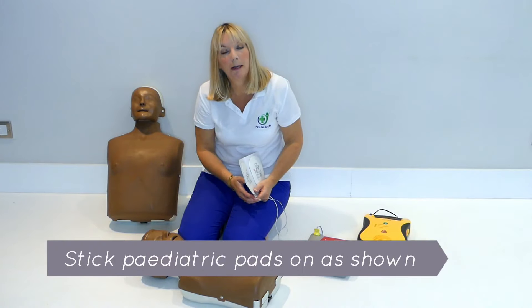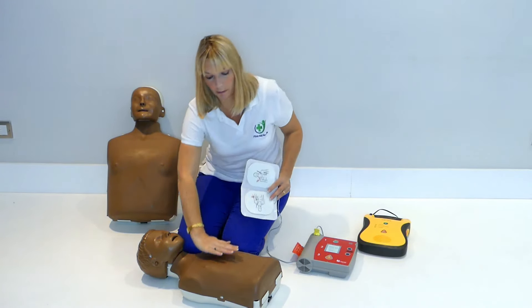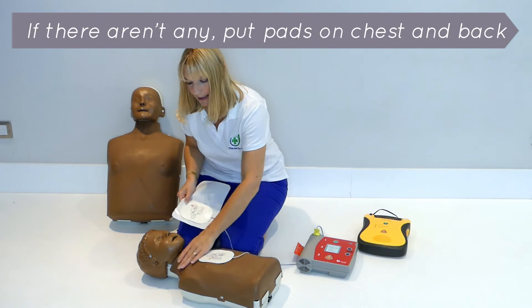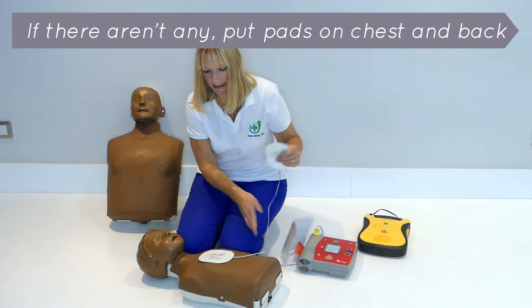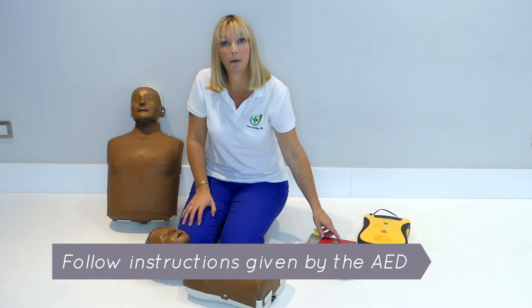If you don't have pediatric pads, you can use adult pads. You put one on the front of the chest and one on their back, right in the center. Then you would be doing CPR over the top and following the prompts on the machine.